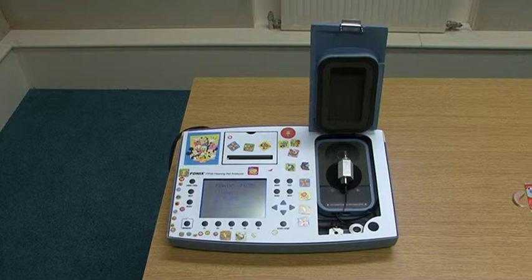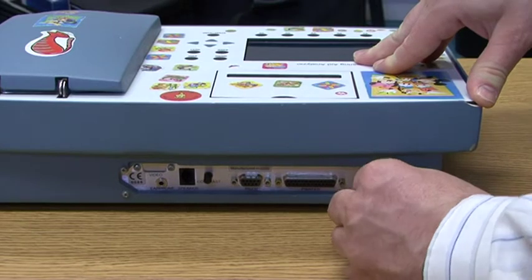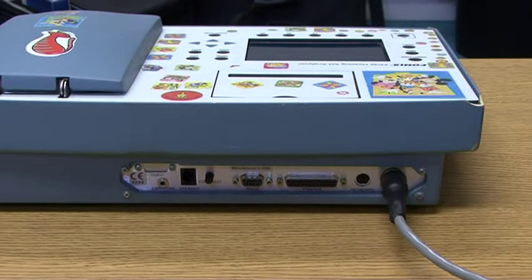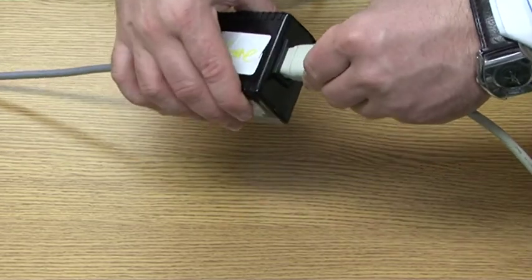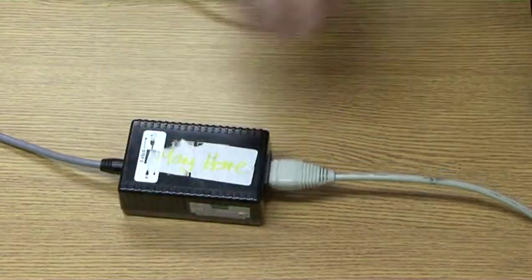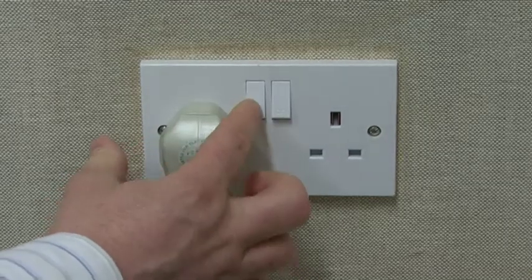Before using the test box, it will need to be connected to a main supply in the following order as demonstrated. Connect the power supply lead into the back of the test box. Next, connect the mains power lead to the power supply unit. Plug the mains power supply lead into the socket and switch on.